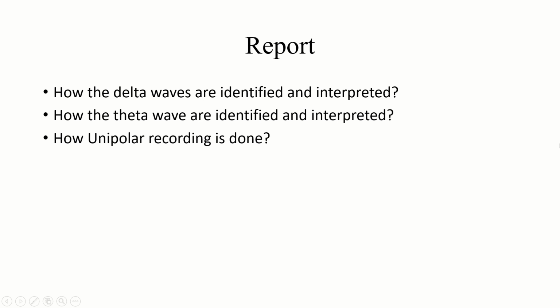Now the following questions are to be reported. One is how the delta waves are identified and interpreted. The second is how the theta waves are identified and interpreted. The third is how unipolar recording is done.